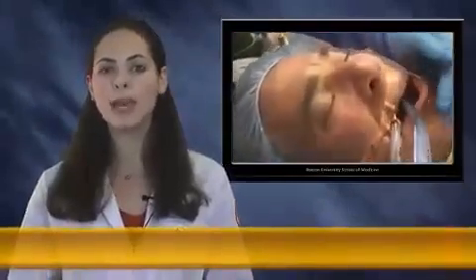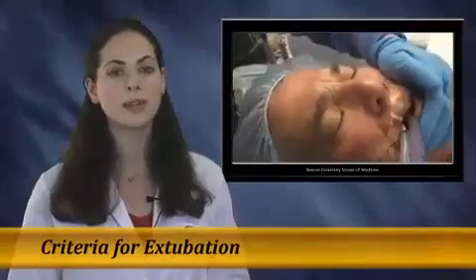Once the patient's neuromuscular block is completely reversed, and he or she has emerged from the anesthetic, the anesthesiologist prepares to remove the endotracheal tube. Several criteria must be met before proceeding with extubation of the trachea.